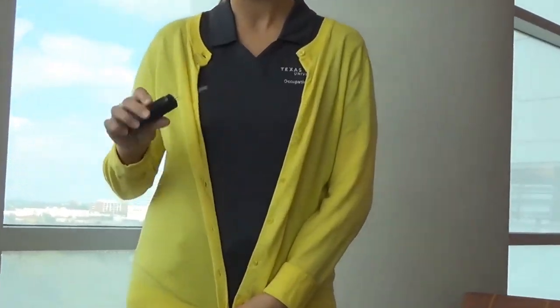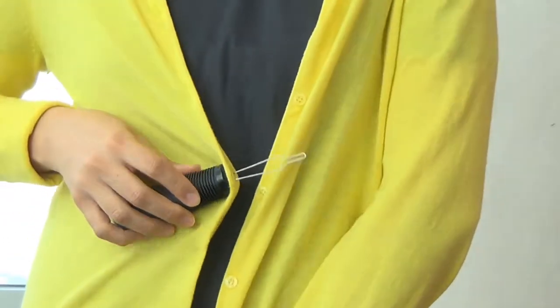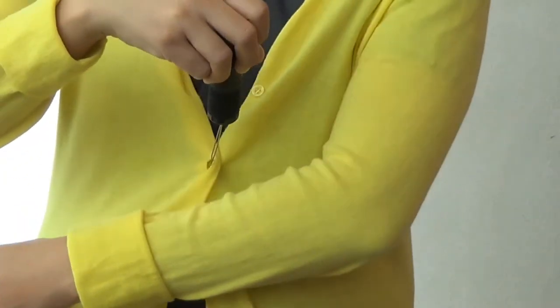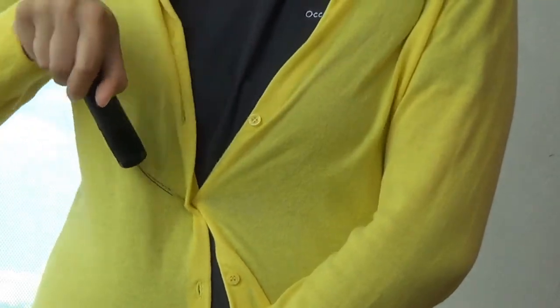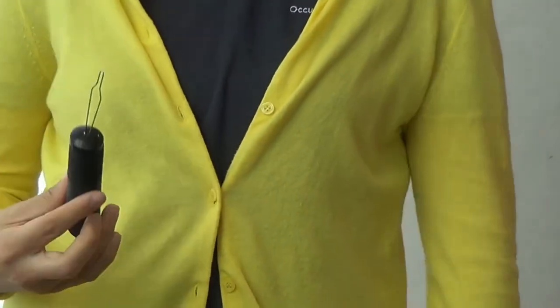So first, take the Good Grips button hook. Push the wired end through the buttonhole and then around the button. Stabilize your shirt if you can. Bring the button through the hole, down, and then around, just like this. Then un-loop the button hook and there you have it.